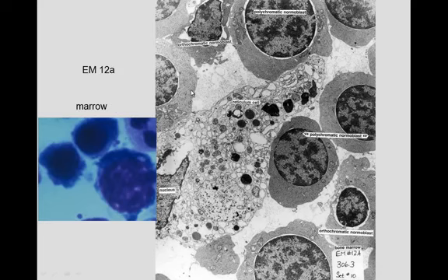If we look at these with electron microscopy, we can see a nurse cell. Here's its nucleus, and there's the nurse cell inside there. And we can see some polychromatic normoblasts. You can see nuclear pores still attached, but the nucleus is condensing, ultimately to be removed from these cells.